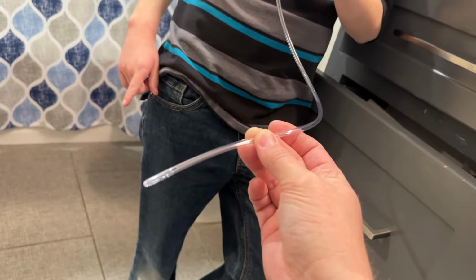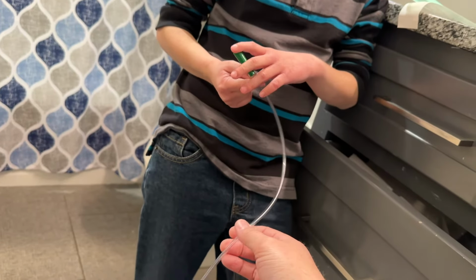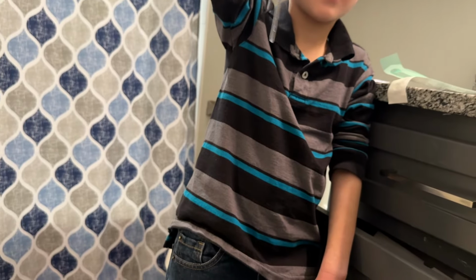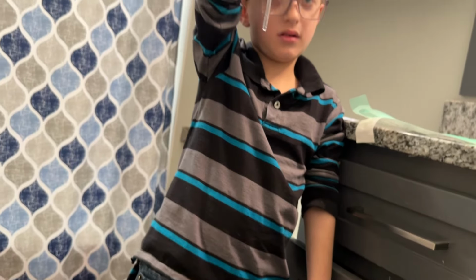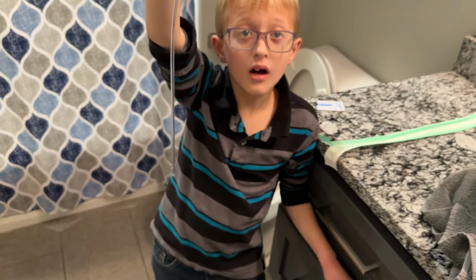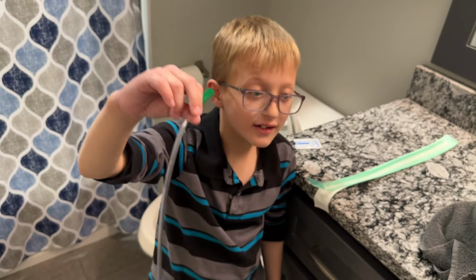The reason we like the bigger catheters is because when you have an augmentation like Austin does, usually the augmentation is done with intestine. And intestine, by virtue of what it is, makes mucus. So the larger the catheter, the faster the mucus can come out along with the pee, and then there's less of a chance for clogs. If you have too much mucus, then it can create stones, unfortunately, but we also do irrigation, which takes about 30 seconds twice a day. Do it first thing in the morning and last thing at night. Goes pretty fast, but that's the only other thing.